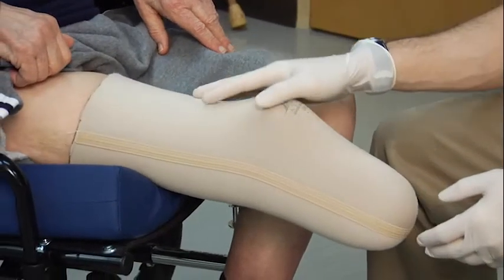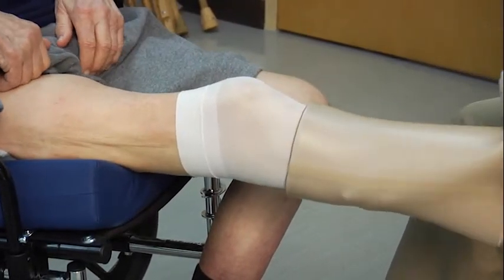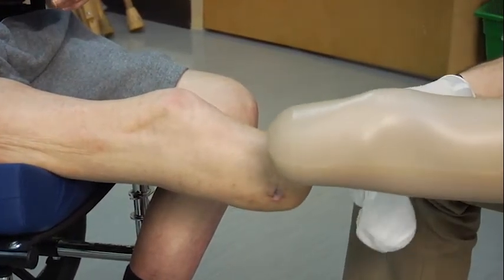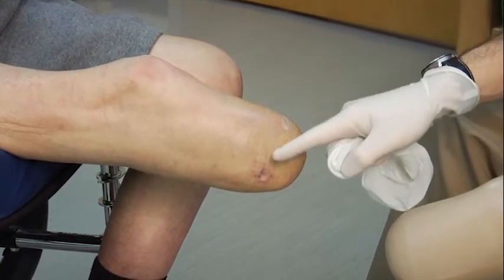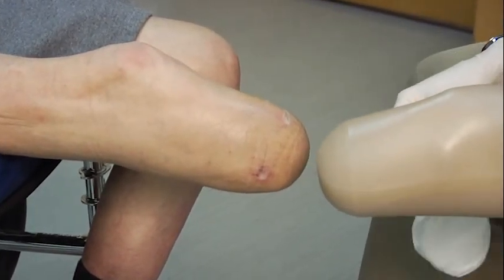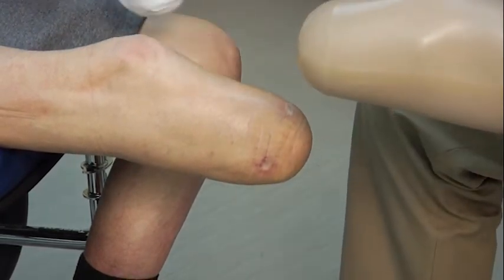Once we've taken the leg off, we need to remove the gel liner to do a visual inspection of the patient's limb. The purpose is to make sure the patient hasn't sustained any type of injury. We're going to do a visual inspection of the patient's incision line, the tibia, and the fibula to ensure there are no red marks or unusual markings that the patient may have incurred while wearing the prosthesis. As we can see, there are no issues with his leg, so we can reapply the gel liner.